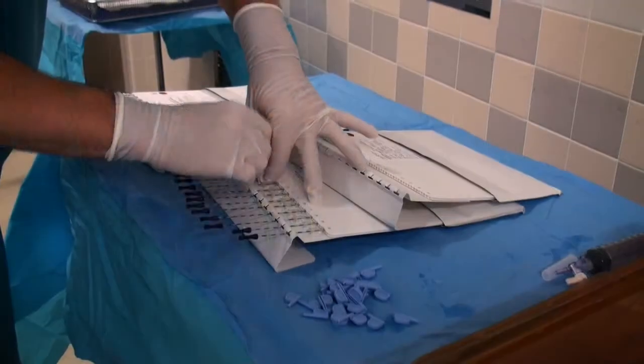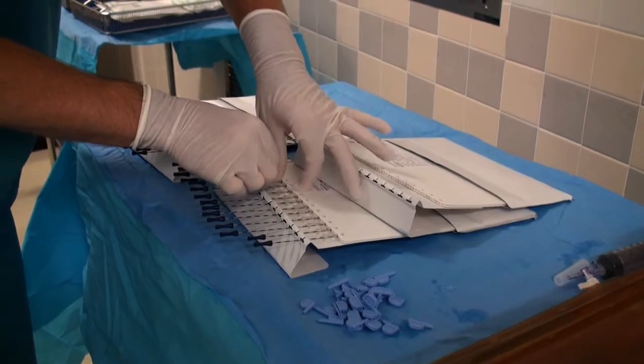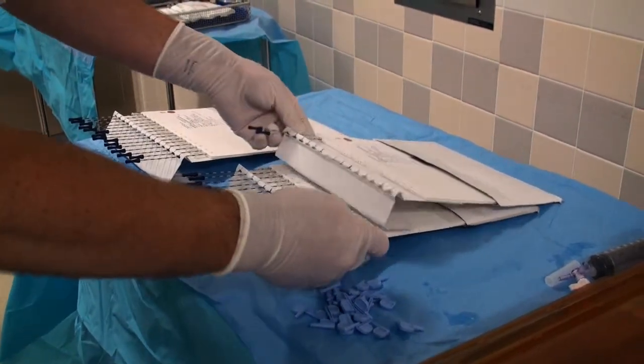As part of the assessment, the patient would need to undergo what's called a prostate volume study for brachytherapy treatment planning. This is a procedure where the prostate gland is measured and images are obtained. This allows us to construct a 3D volume or 3D model of what the prostate looks like within our planning computer system. We can then virtually place the radioactive sources to determine the proper dose distributions to enable a cure, and these seeds are configured in a way within the carrier needles. The seeds are subsequently ordered in this arrangement to allow this to be facilitated at the time of the procedure.